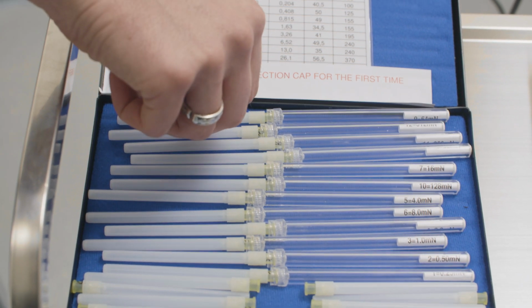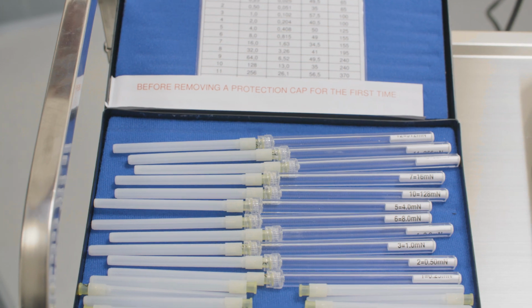By doing that, we can assess the sensitivity of the skin using this calibrated sensory testing device that allows me to deliver a specific force to the skin, and that will in turn result in some sort of perception. So with this, I would place this over the skin, over the area that I've sensitized, and I'll be able to see whether or not it's changed into a painful sensation.